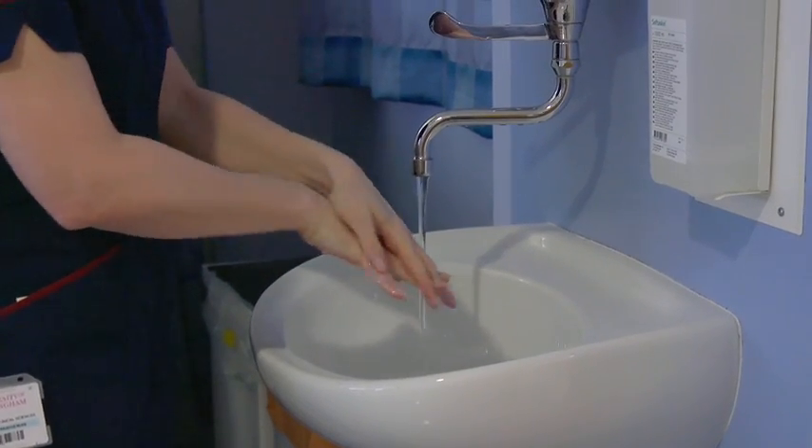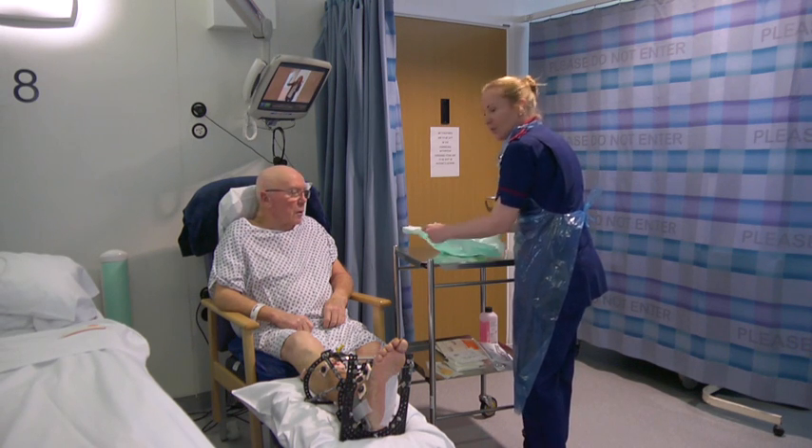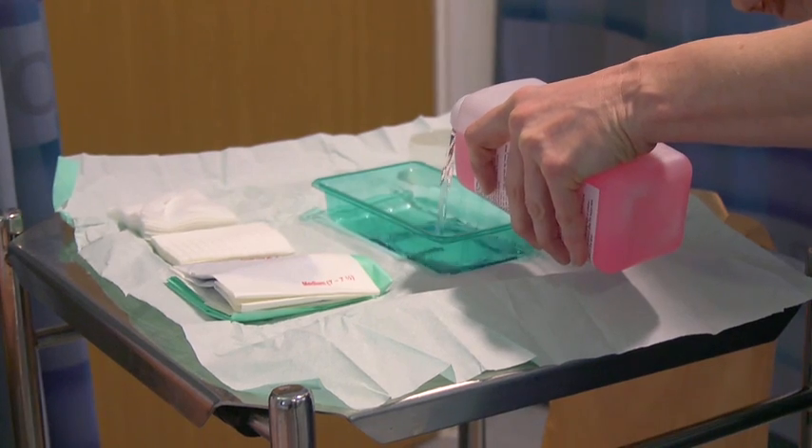After showering, wash your hands thoroughly and open the dressing pack onto a table or tray, getting all your dressing equipment ready before you start.